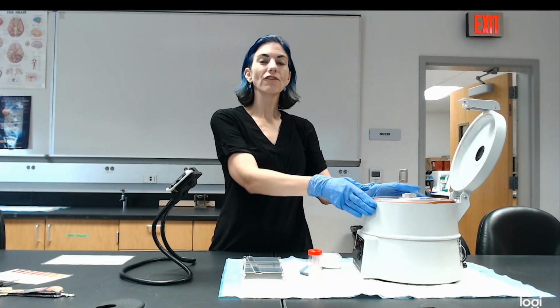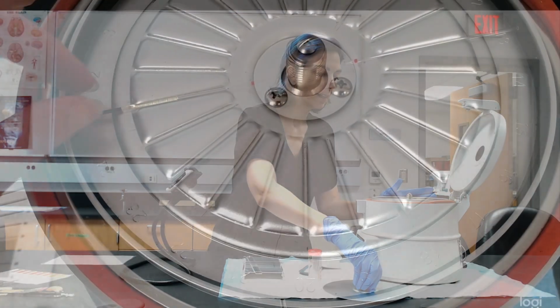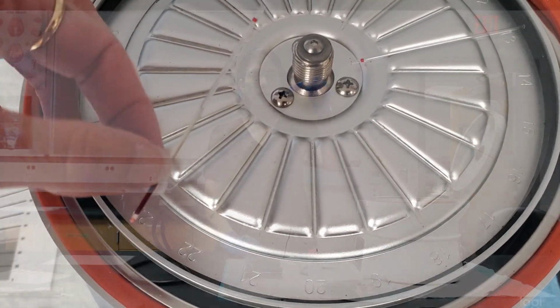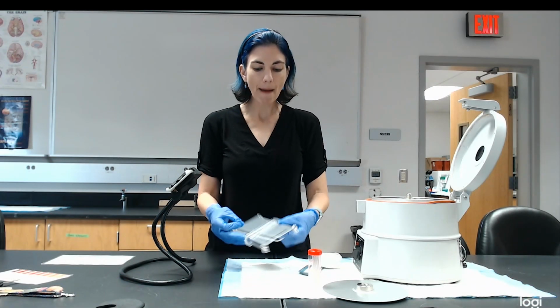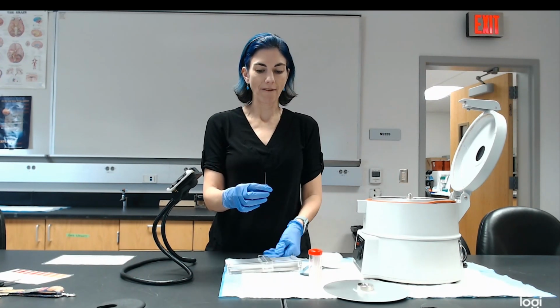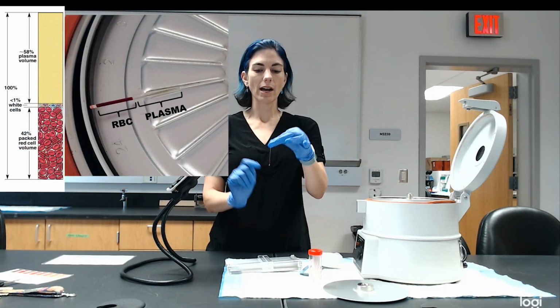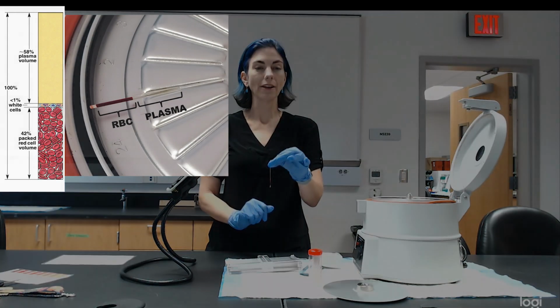Okay, so the centrifuge spun for 3 minutes. Now we're going to unscrew it and take a look at my blood. So here's my blood there. But now what we're going to do is use a hematocrit reader to look at the percentage of my blood that is the dark stuff, the red blood cells. So there's a dark area below and a light area on top. The light area is the plasma. The dark area are the red blood cells.